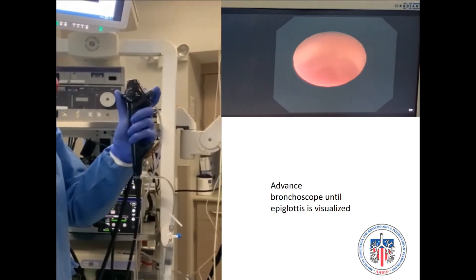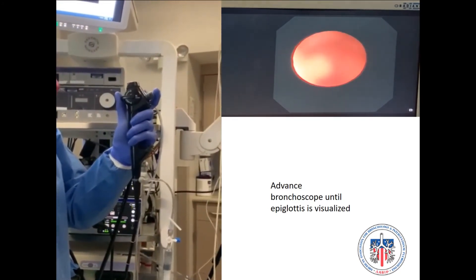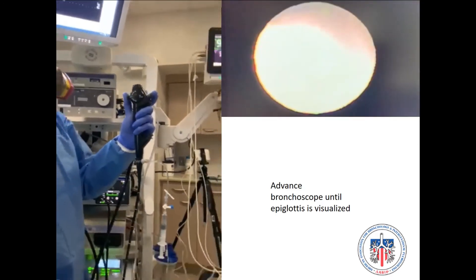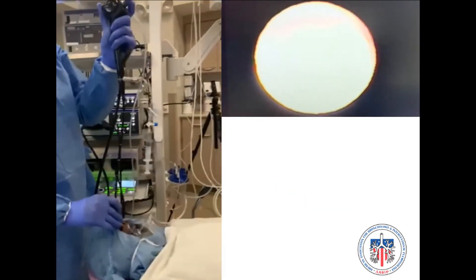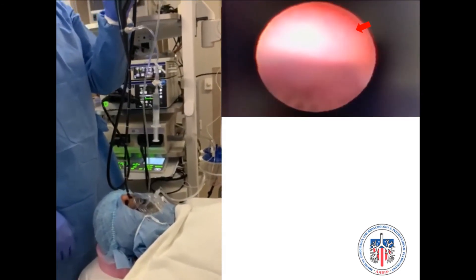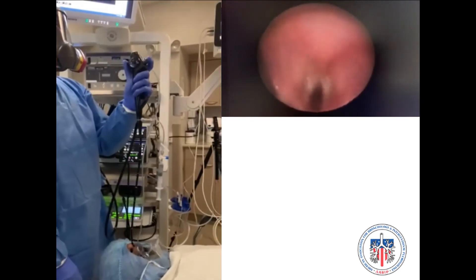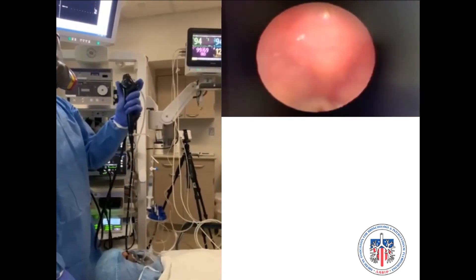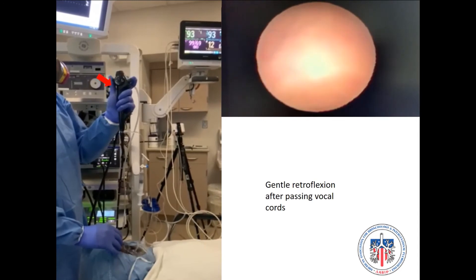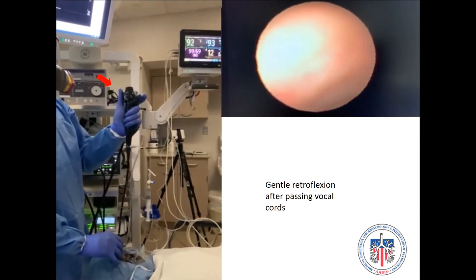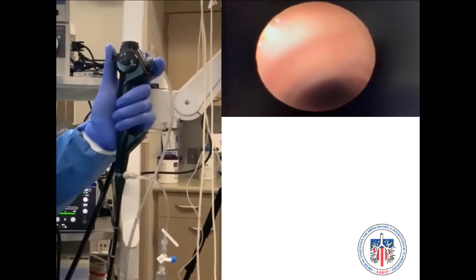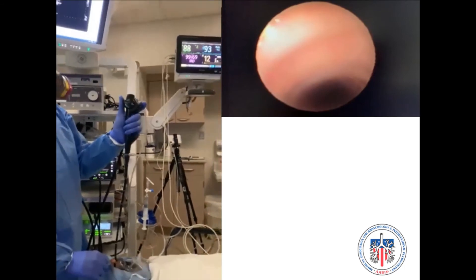Visualization of the epiglottis will be seen in slow motion in this video. We will position the scope under the epiglottis and advance towards the vocal cords, specifically towards the anterior commissure of the vocal cords and not to the center of them, as we do with a standard bronchoscope. Right after we pass the scope through the vocal cords, we apply a slight retroflexion with the scope in order to align with the anatomical angle between the larynx and the proximal trachea.